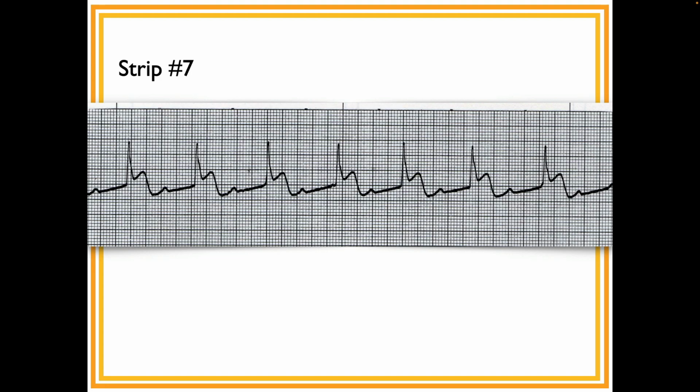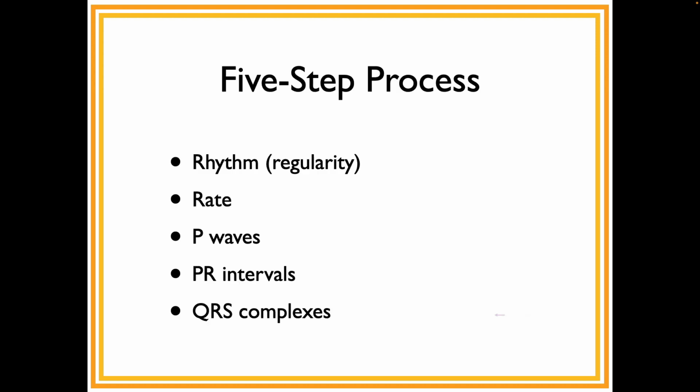So for example, here, look how long this is. In fact, this is an extremely long one, right? What is this? This is like 5, 10, gosh, about 13 small boxes long. So this is an extremely long PR interval, so too long, okay? We'll do the last bit and then we'll take a break.